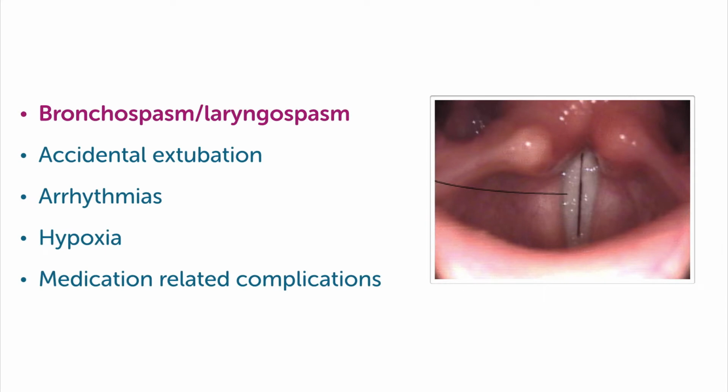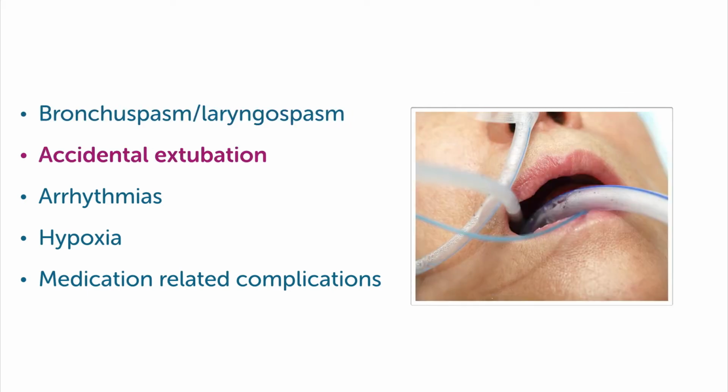Another complication are bronchospasm and laryngospasm. Some patients just react very sensitively. You have to also be aware that this could be a reaction to the lidocaine spray that you give the patients. Furthermore, accidental extubation. If you have a patient who is intubated and you pull on the tube instead of the TE probe, you would extubate them.